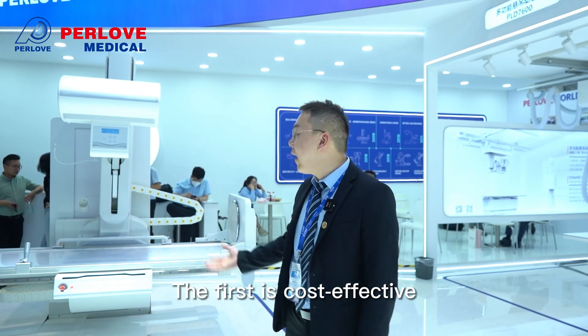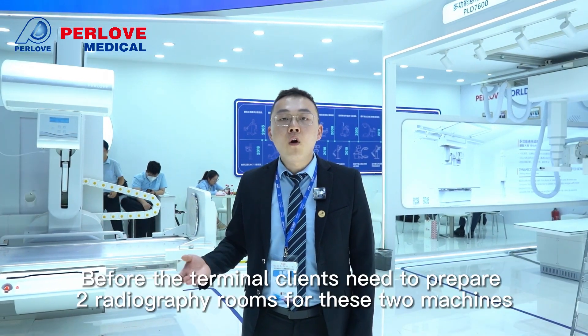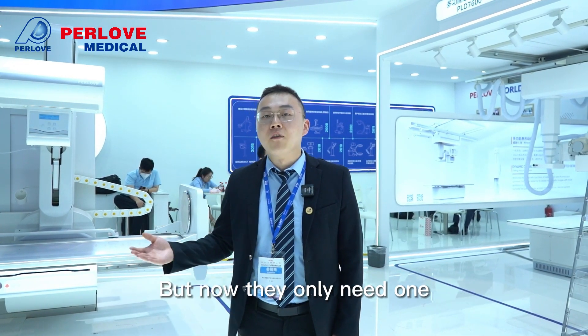The first key point is cost effectiveness. The DRF system can realize both radiography and fluoroscopy. Previously, the client needed to prepare two separate rooms for these two machines, but now they only need one.